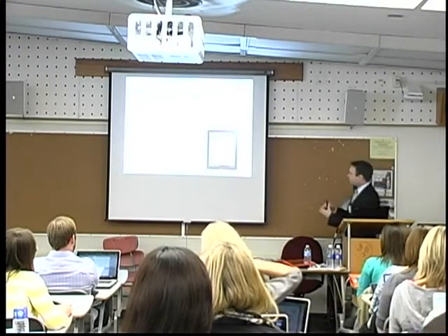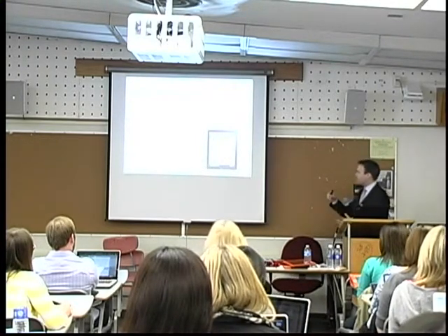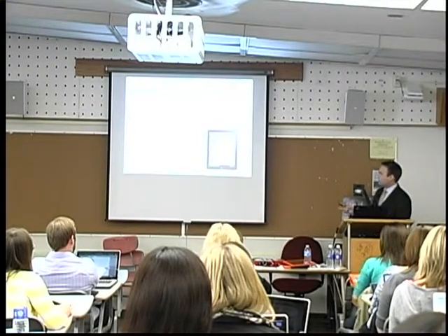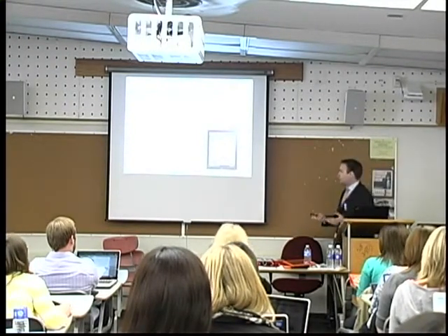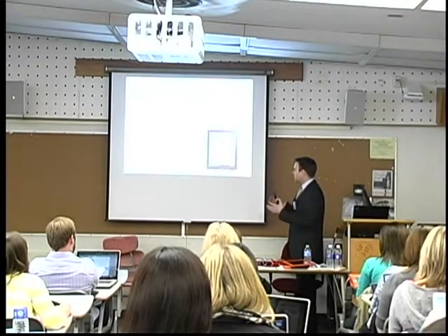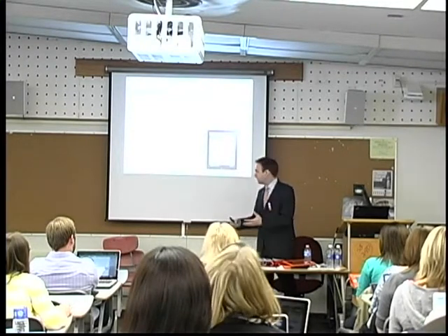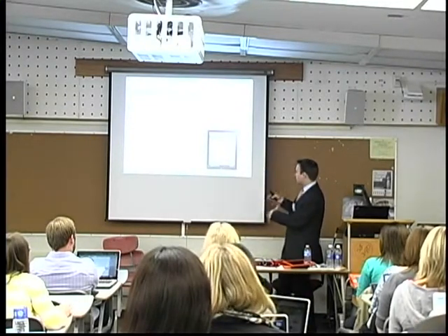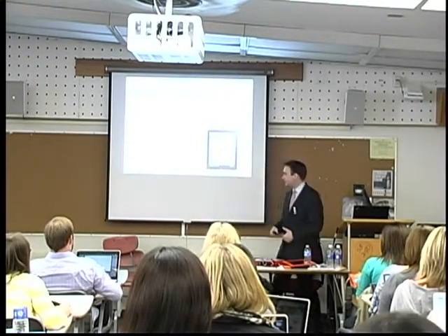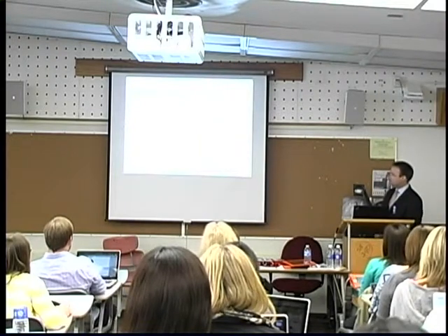Lots of graphic symbols around there. Not too difficult to understand the concept, how to touch and activate graphic symbols on the screen. It might even be socially appealing and enhance peer acceptance, because the learner with autism looks kind of cool and can more easily make peer connections if he or she walks into a classroom with an iPad and other kids get to join in and also play with that iPad. So those are all arguments that have been suggested for why that is a proper choice.